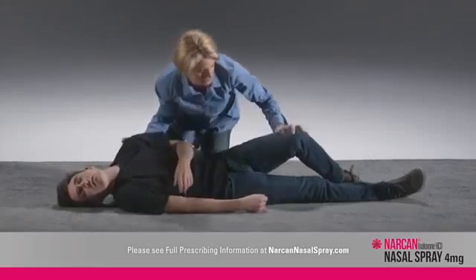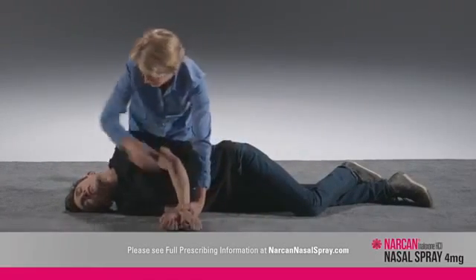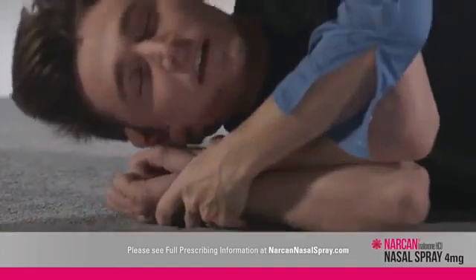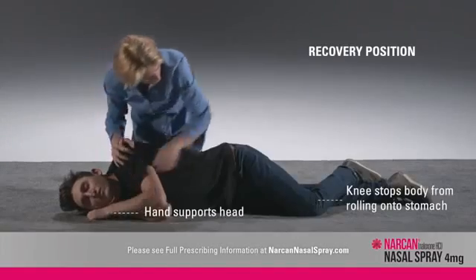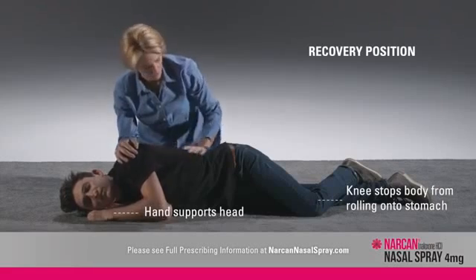Move the person on their side after giving NARCAN nasal spray. If possible, put their hands under their head and bend their upper leg forward. This helps prevent the person from rolling onto their stomach. This is known as the recovery position.